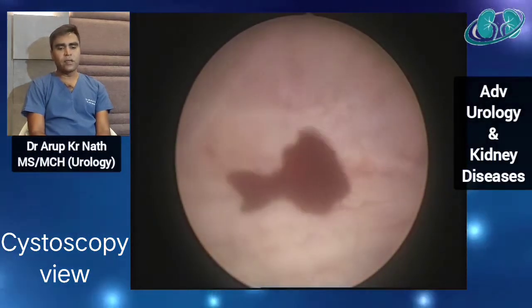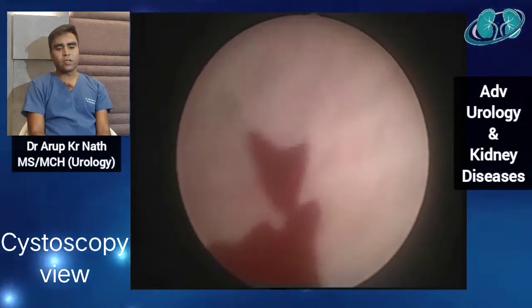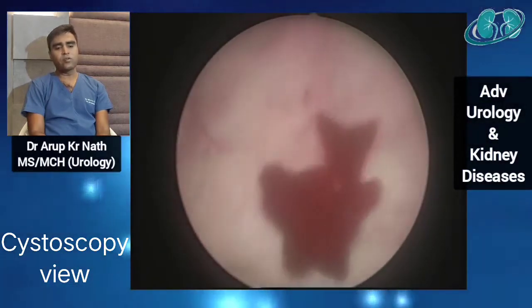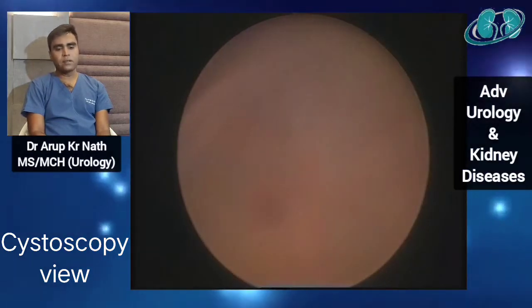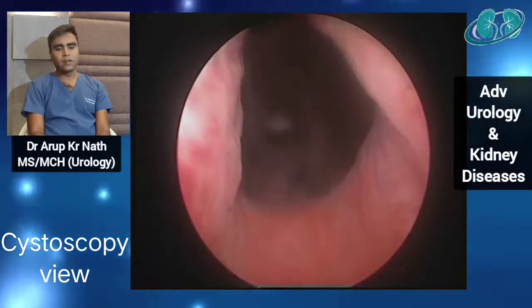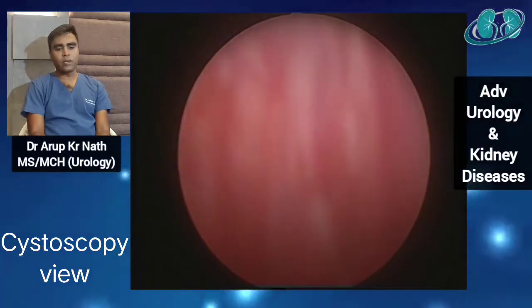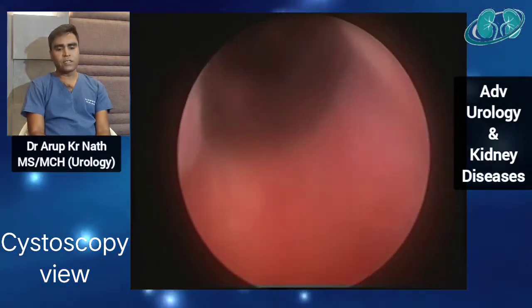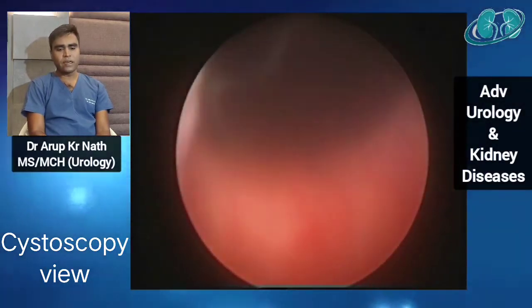Here you can see the bladder, a small bladder clot is there. Otherwise there is no evidence of inflammation, no sign of tumor, and no visible tumor. Here you can see the bladder neck, which is wide open. The prostatic urethra, you can see, is showing some kind of inflammation.